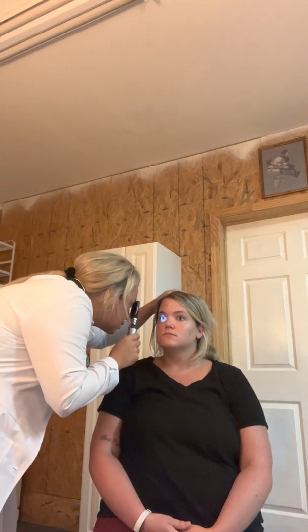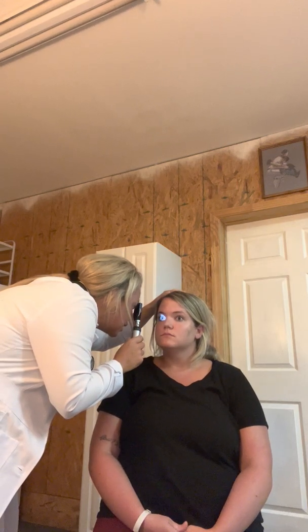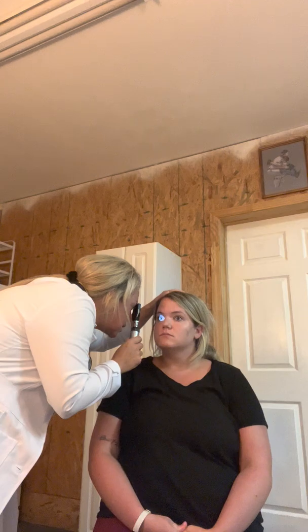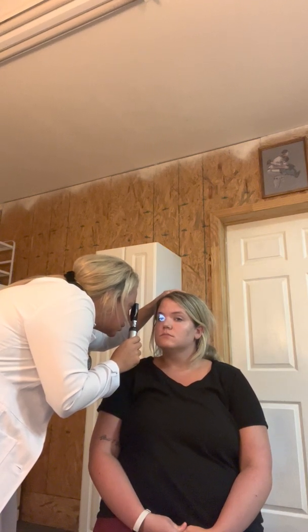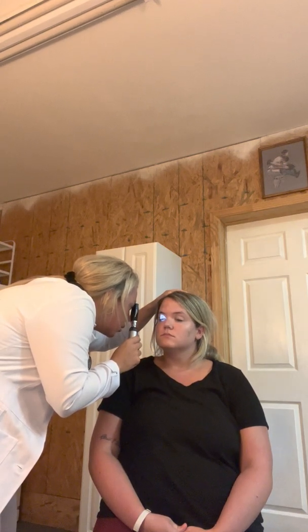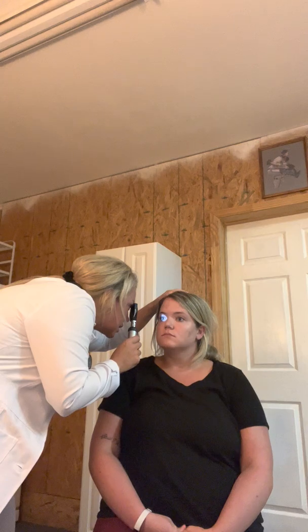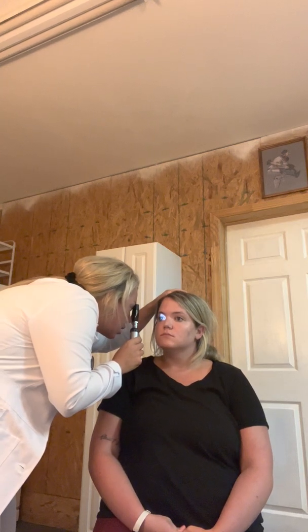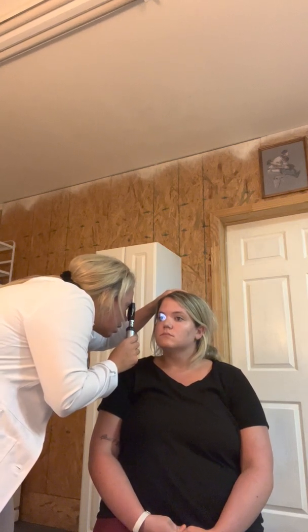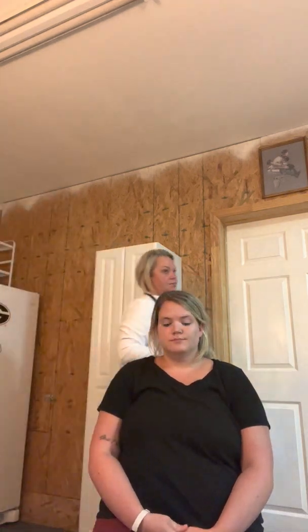All right. So I can see the red reflex. The optic disc is very sharp and well outlined with sharp borders, which indicates no congenital abnormalities of the eye, no cataracts. Good. All right, I'm going to go to the left side.